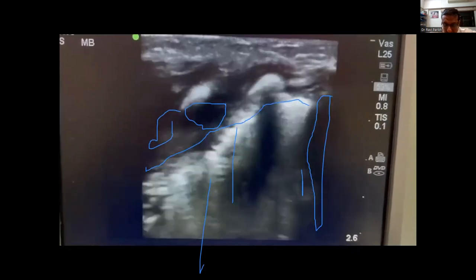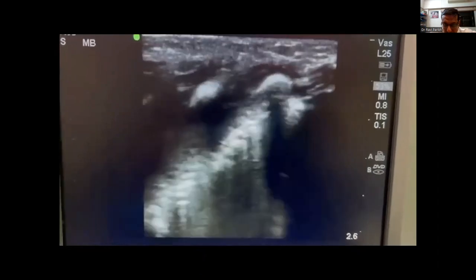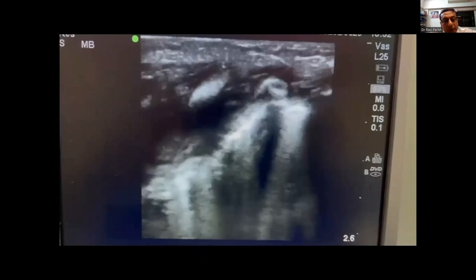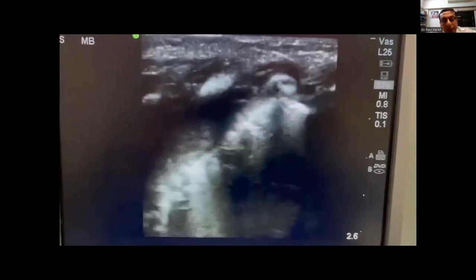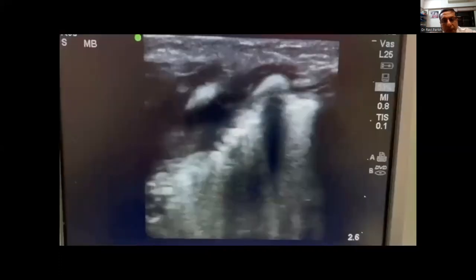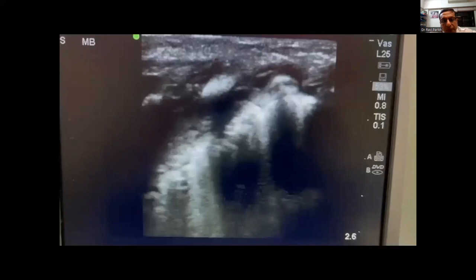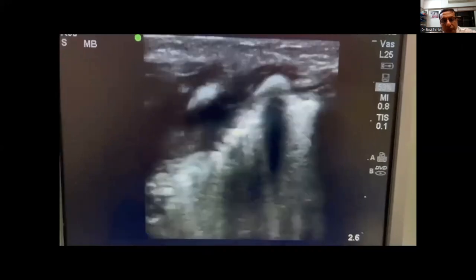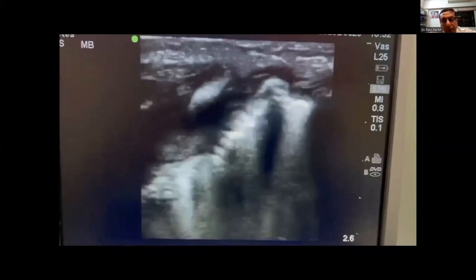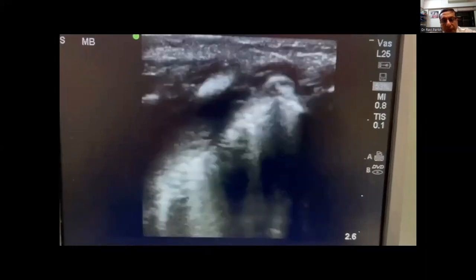And if you find it confusing, because normally we expect pleural effusions to cause uniform atelectasis, it's not always the case, because you might have underlying pathology in the lung itself that is causing the lung to become atelectatic and abnormal. Again, with this kind of B profile and those static air bronchograms, you do worry about the potential of an infective process as well. So I'd be very curious to know what the clinical course is.